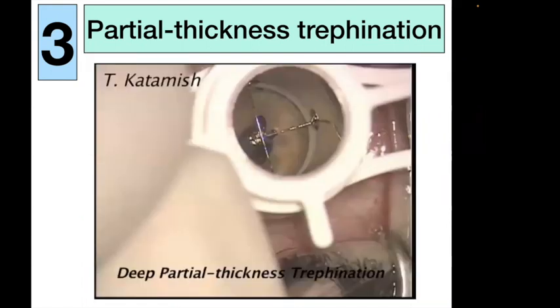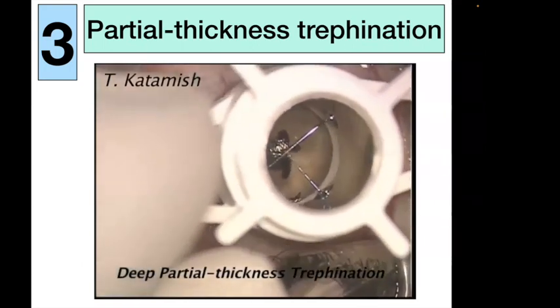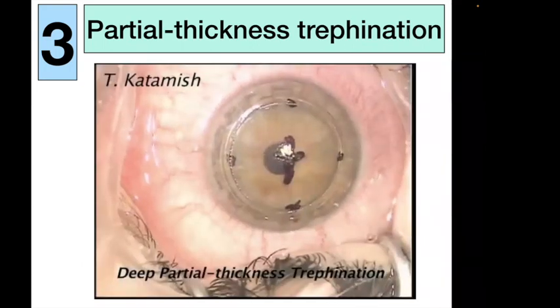After calculation, you go on the patient's eye and you do your trephination, and then you will look to the depth.